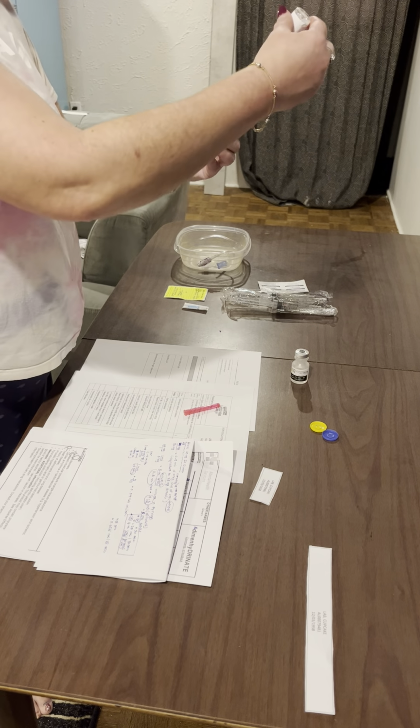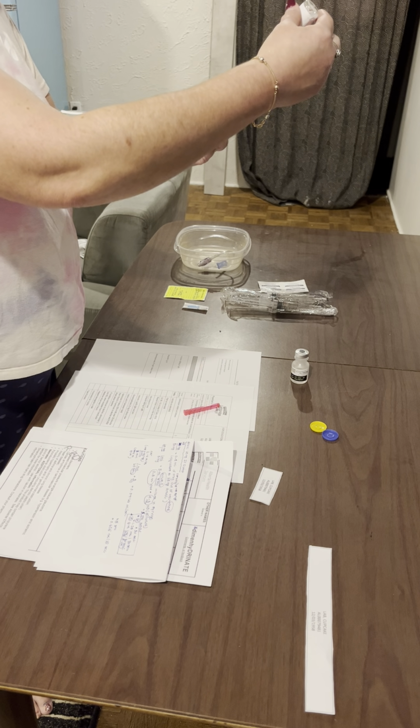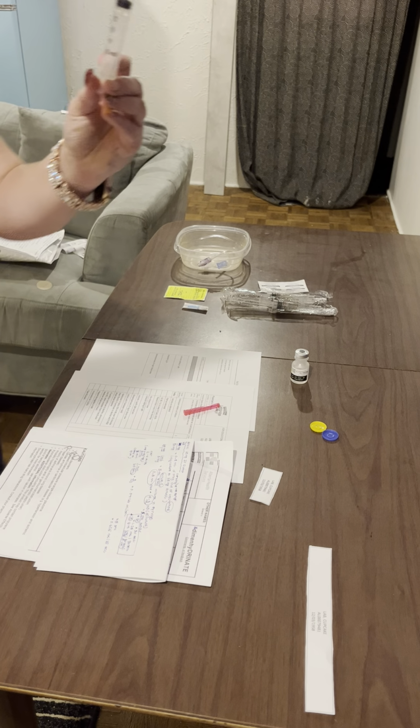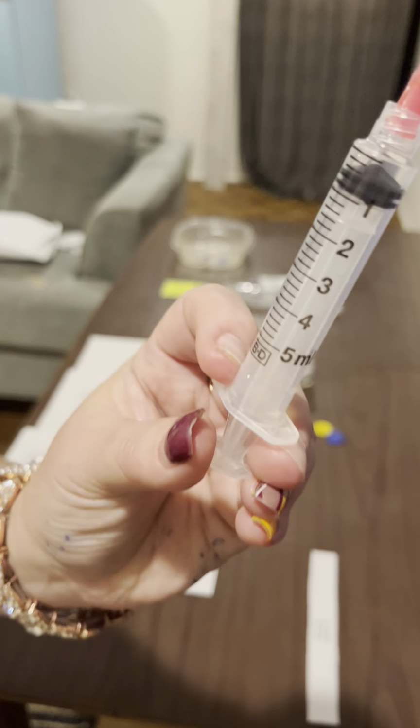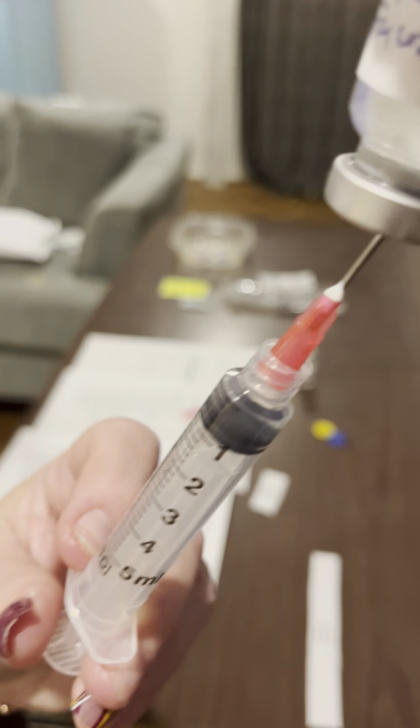Then we're just going to turn this upside down, and we are going to pull back until we get 0.5 mils of air, and as soon as that happens, I will show the camera. So 0.5 mils of air here, double checking, 2, 4 right in the middle, 0.5 mils of air, and you can see it's dimenhydrinate.